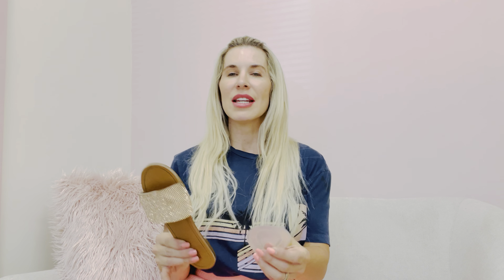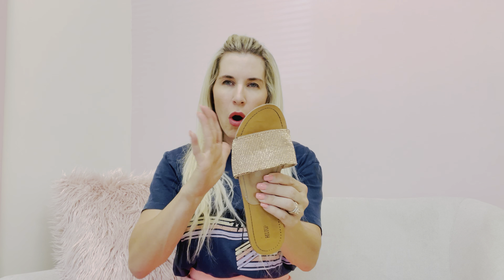Another great way to bring control to an otherwise flat sandal is to use a heel wedge. This is one of the most common ways that orthotics actually bring support to the foot — through wedges. You place it on the inside of the left sandal so that when you stand on it, it's going to tilt your heel into a more neutral or supported position. Utilizing that heel wedge is really great for anyone who might have plantar fasciitis, post-tib tendonitis, overpronation, or foot fatigue. You can even combine the heel wedge with the shoe bubble to get a little bit more support.